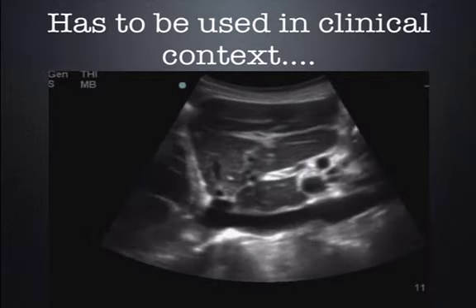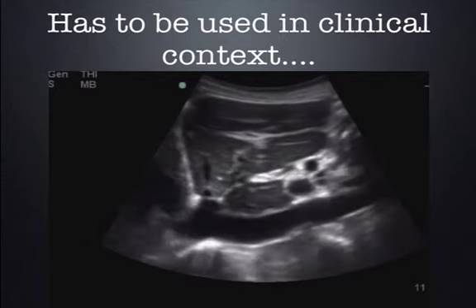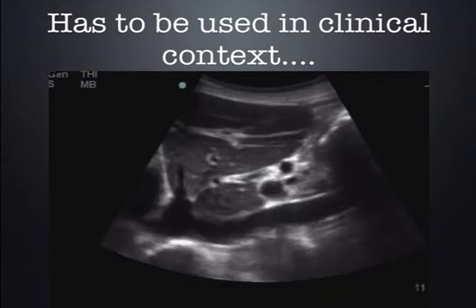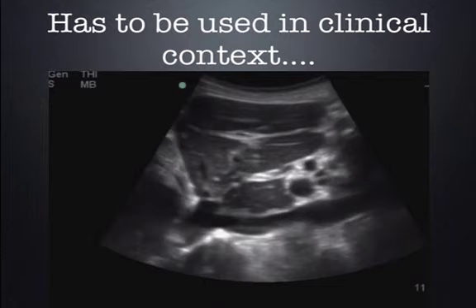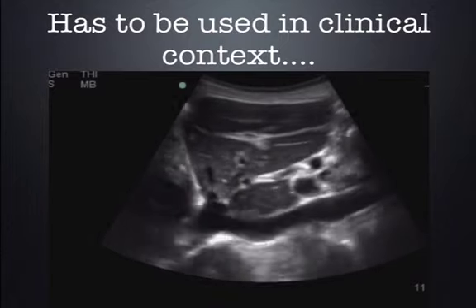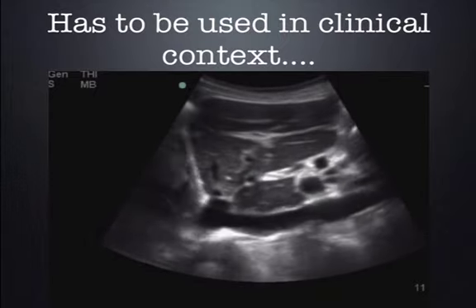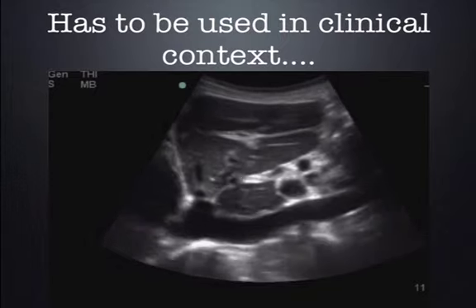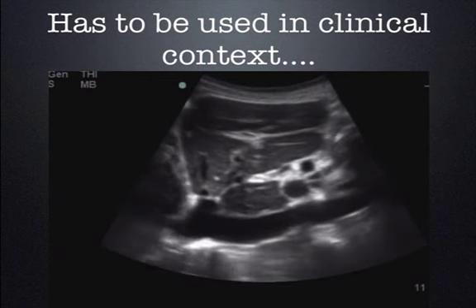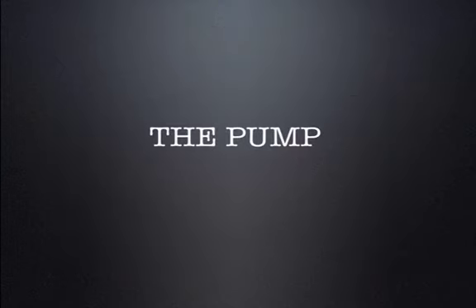Just because it's collapsing doesn't mean that patient is critically ill. Just because it's full doesn't mean that patient is critically ill. Just because the IVC is full doesn't mean that the patient is not fluid tolerant or fluid responsive. You just use the ultrasound as a guide for your differential diagnosis and a guide for the resuscitation of your patient. Once I've evaluated the IVC, I usually advance on to the heart, particularly if the IVC is plethoric.